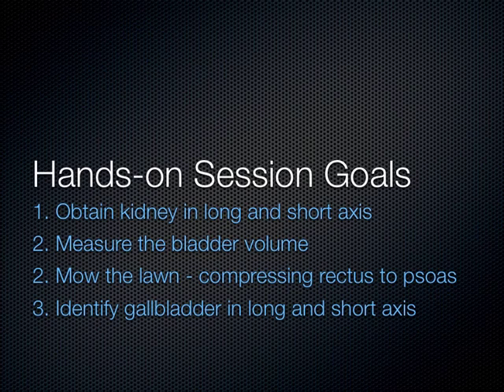Okay. Yes? Putting the right leg as far as you can over the left, why? Yeah, that's a great question. That comes up all the time. Why would you put the right leg over the left leg? I think it has an effect on the psoas muscle, brings the psoas muscle maybe a little bit more anteriorly. That's one of the things I can think.